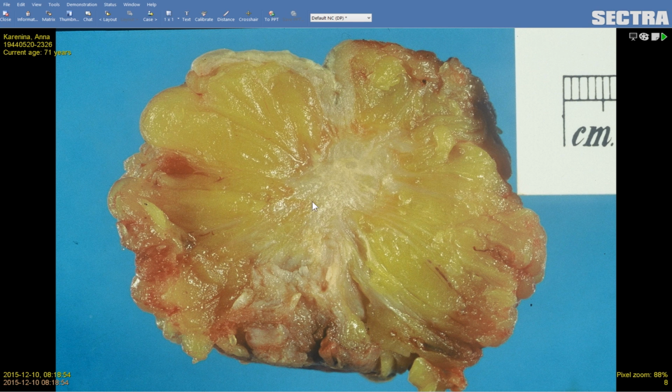And also, even though there are photographic images, I can actually make measurements. But to do that, I will have to calibrate them before that, using a ruler or other known object in the image. And then I can perform a distance measurement, area measurement, or other such measurement, even though it is photographic information.